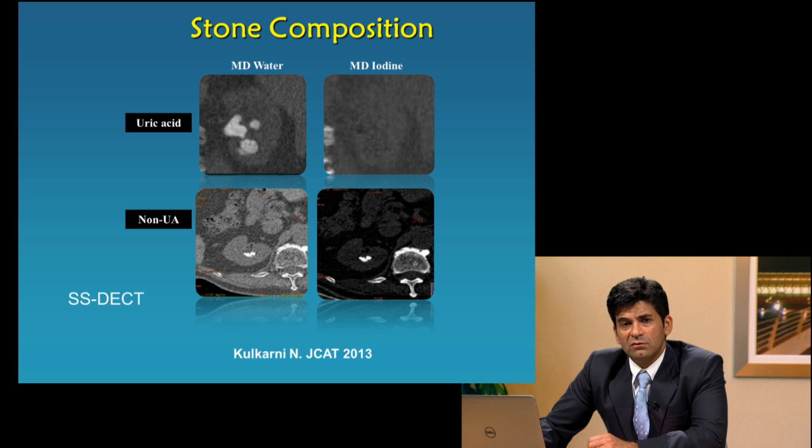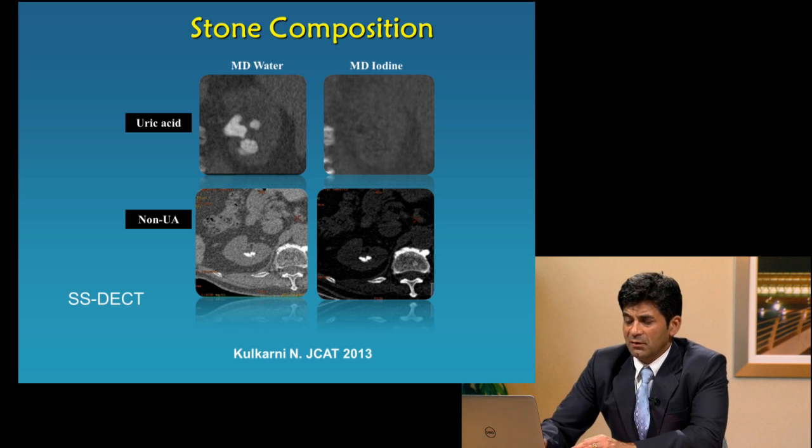We can dissolve these stones by changing the pH of the urine and altering the patient's diet, whereas the stones of intermediate hardness require shockwave lithotripsy, and those that have a higher amount of calcium are hard to break and require more invasive therapy.